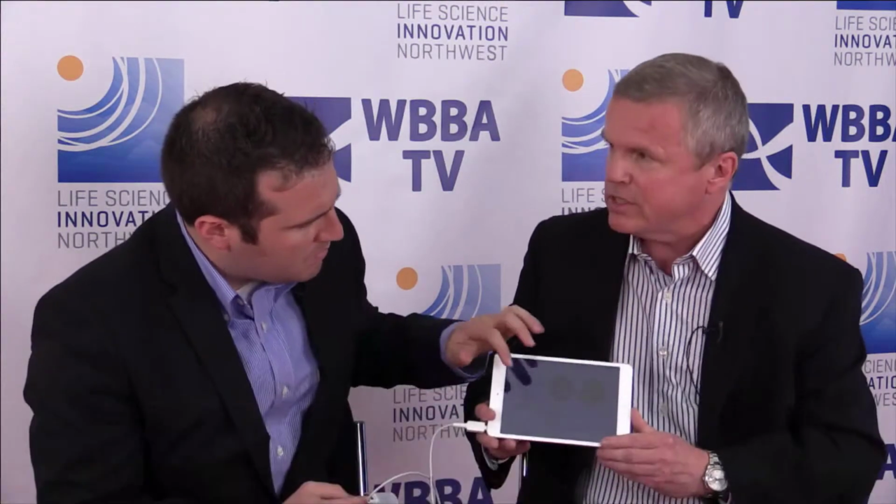So they needed to get at things like oximetry, which we're showing you here, which non-invasively shines light through your finger and gives your oxygen saturation, which we can see there is 97%. What that's telling us is that 97% of the hemoglobin molecules in your blood have an oxygen molecule bound to them. So you're fairly healthy, which is a good sign. Having said that, if it was much lower, it could be supportive of a diagnosis of pneumonia.